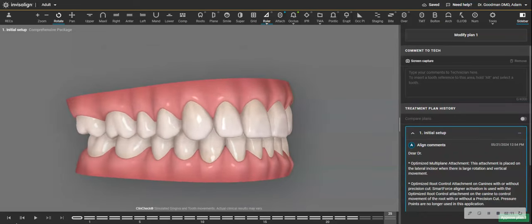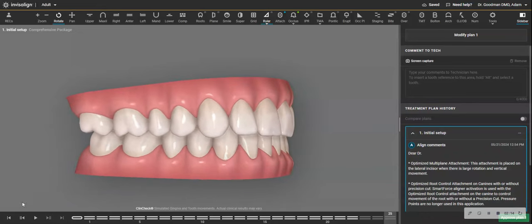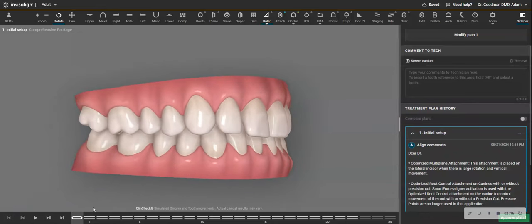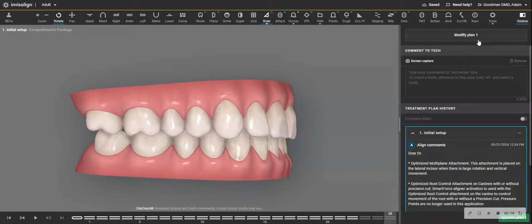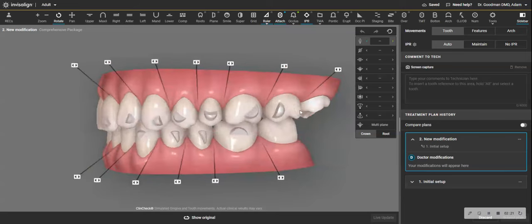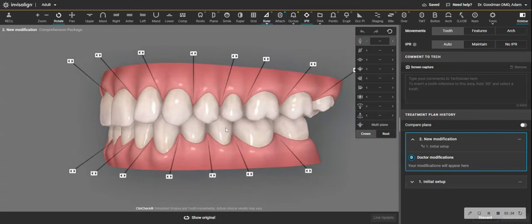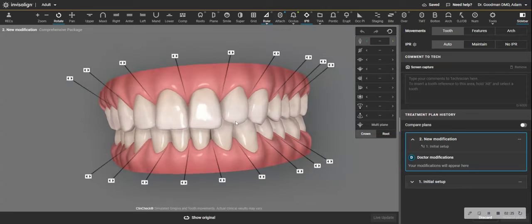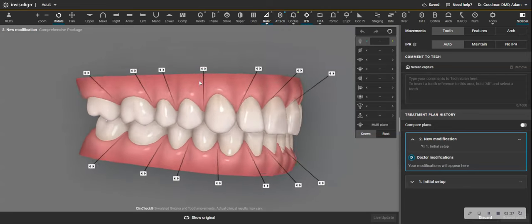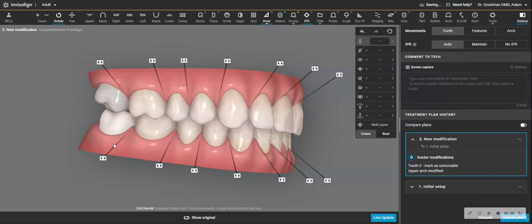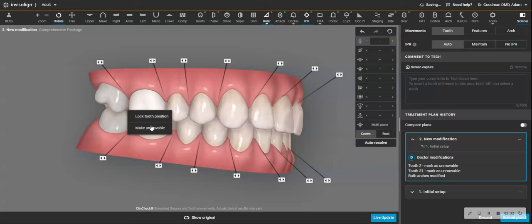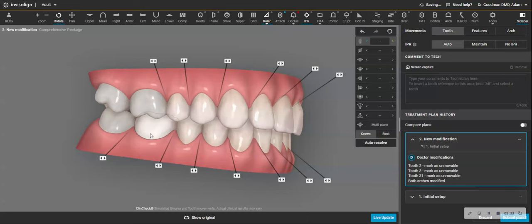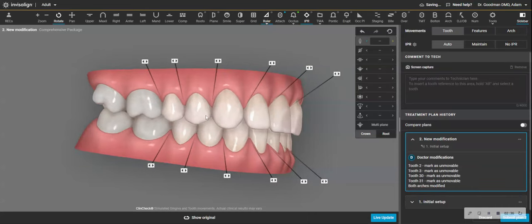So my ClinCheck is showing movement here. And the question is, do I need this? Do I need that buccal root torque on that upper right second molar? So my secret here to keep a predictable treatment plan and also to minimize attachments is going to be to take a look at this ClinCheck and evaluate it without any movement whatsoever of the molars.